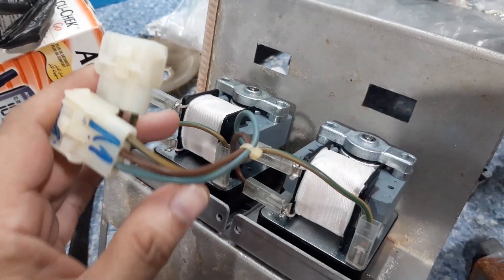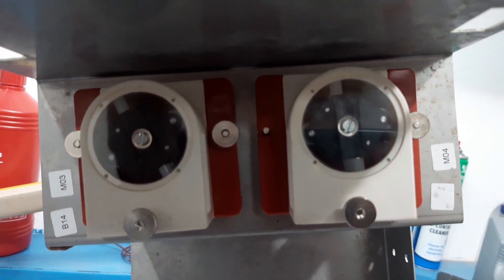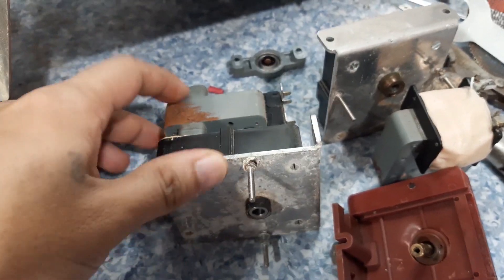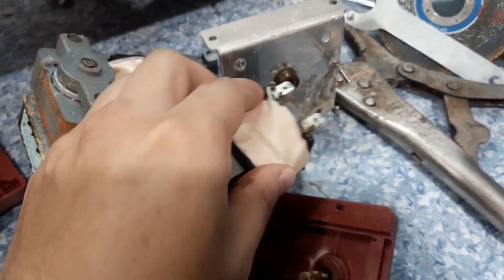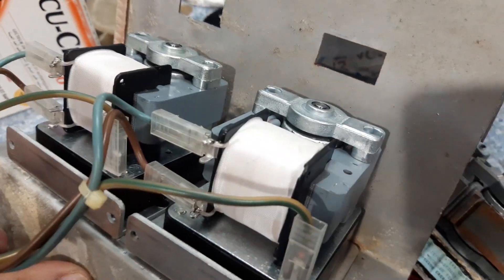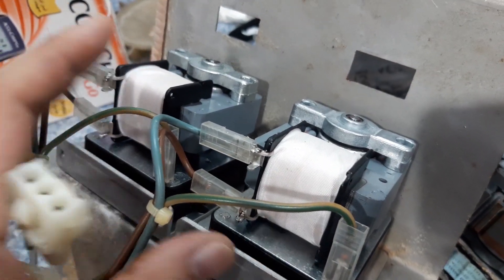I already connected the two new dosing pump motors. And this is the old ones. So let me return this to the unit and we will try to run it.